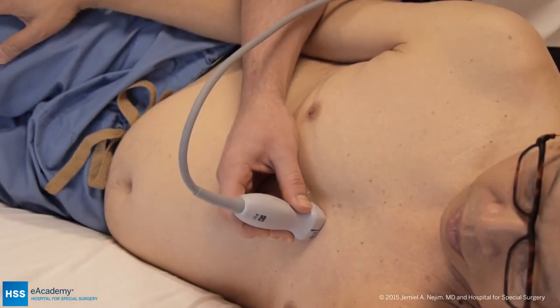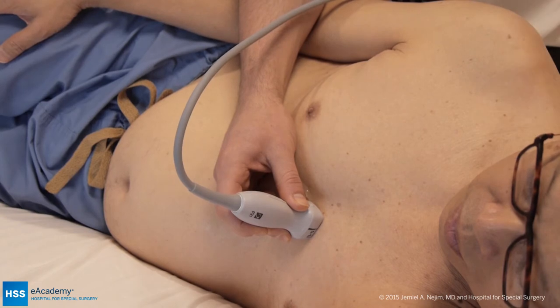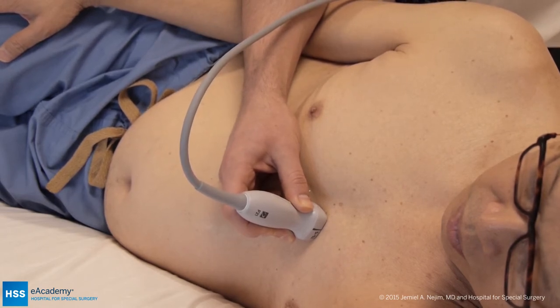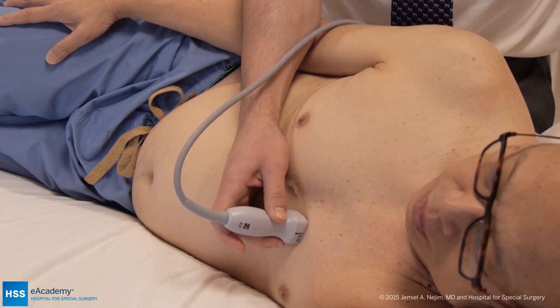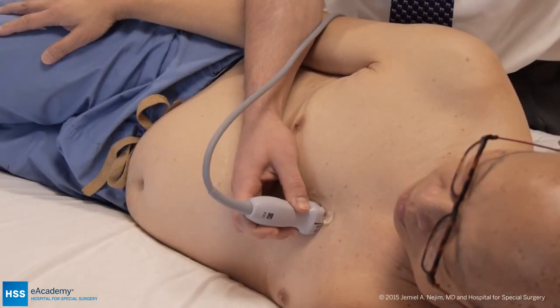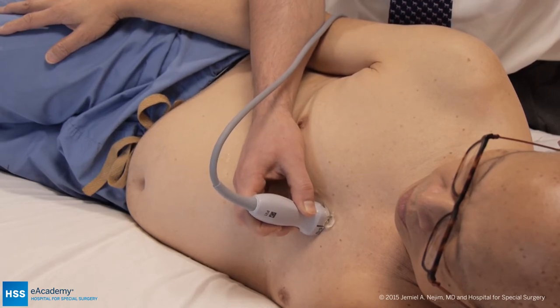The next view, position three, is the parasternal long axis view. I hold the probe parasternally between the second and the fourth rib interspace. Unlike other positions, the orientation marker needs to be facing towards the right shoulder. The ideal patient position is in the left lateral decubitus position. You want to hold the probe right next to the sternum between the second and fourth interspace. Small angulations and rotations can help to optimize the left ventricle.